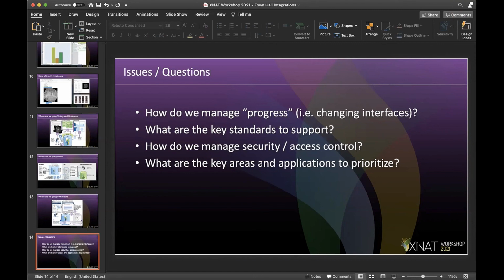Right. So I don't know if Dan or anyone wants to comment on how they've approached that, Dan Beasley or anyone else who's been working on the REDCap integrations. I can comment for Dan if he's not muted. So basically what we've created is not really integration between the two. You can take a REDCap dictionary, the CSV file, and upload that into a script that generates an XNAT form, so that you just put that as a data type and can store your information there. So it's to speed up the process without having to go within the template and things like that.